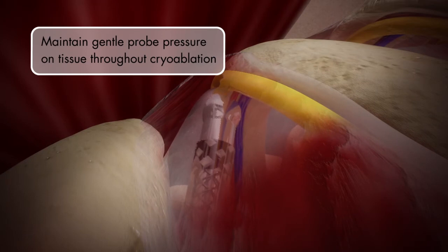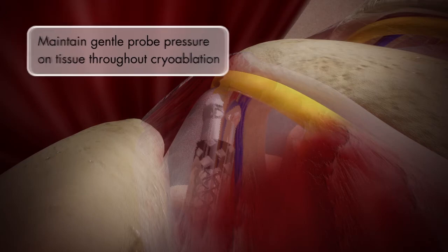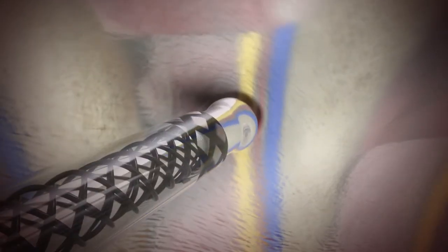Before entering freeze mode, always confirm the placement of the ball tip is as desired and there is no undesired tissue contact with the ball tip or shaft to prevent unintended cryo adhesion and/or cryo ablation.